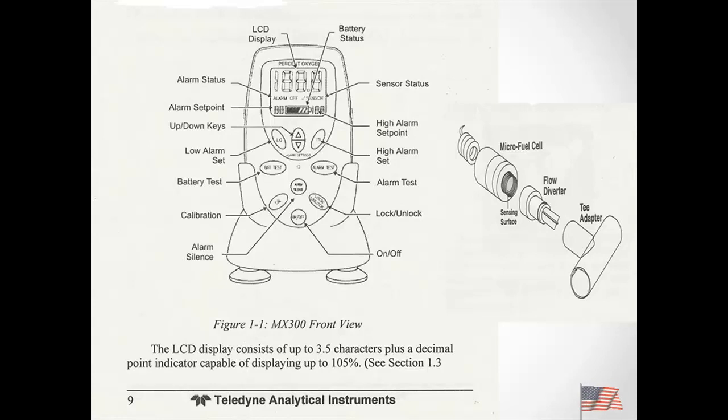Just another example of one that is there, and you can see here this T adapter is how it would be placed in line. So say I had that blue large bore tubing and I wanted to analyze what this system was operating, I could put a T adapter in line and put my oxygen sensor right in there, so I can analyze what percentage of oxygen is being delivered.